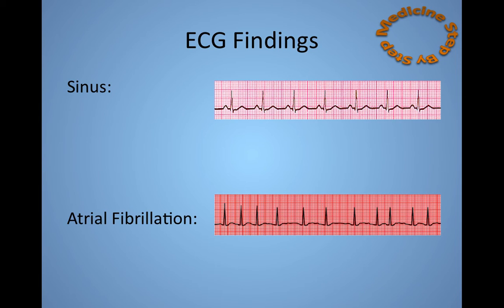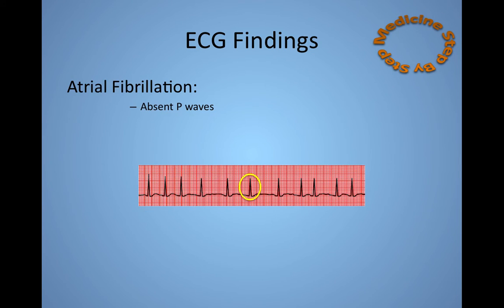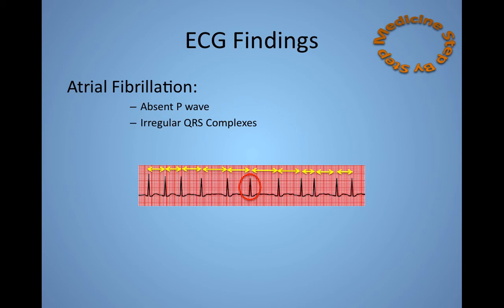An ECG showing atrial fibrillation is different, as can be seen here. There is no P-wave before the QRS complex. As an example, I've circled a QRS complex here — there is no P-wave that can be seen prior to the complex. There are also irregular QRS complexes, as seen by the different length arrows representing the R-R interval.